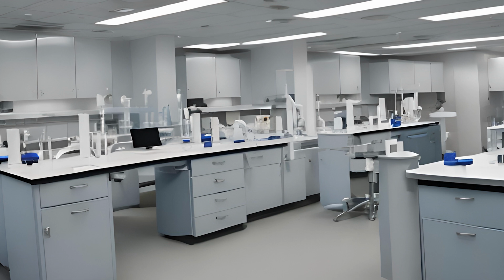This is another time where nurses and lab techs will tend to butt heads, because it's not possible to know if a sample is hemolyzed or lipemic or clotted until you actually check. When you centrifuge that sample and you look for those things and find them, you then have to call the team that brought that sample to you and request another sample.